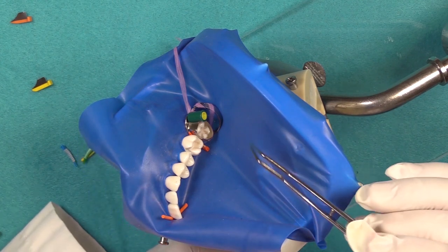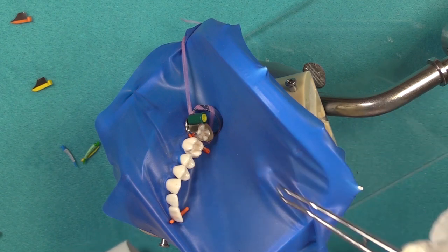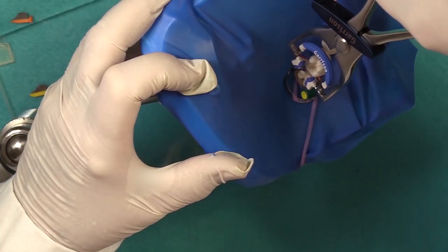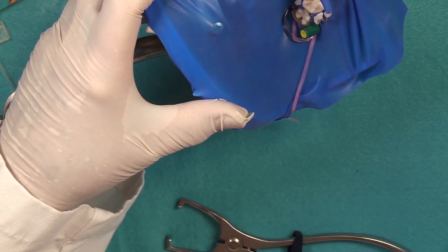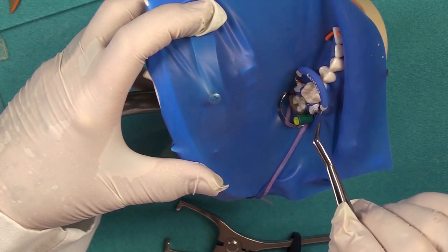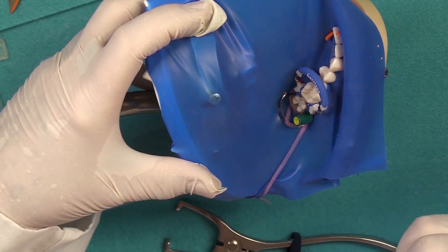As you can see, these work very well with the dental dam. You don't have the pushback — the little rubber filaments help keep it intact and it provides the separation that you need. It's imperative that in order to have a successful restoration, you need to provide the separation. We're going to place our ring. The ring provides separation, fits over the existing wedge, and maintains the integrity of the matrix system so that we can get a nice contour and a good result with our restoration.